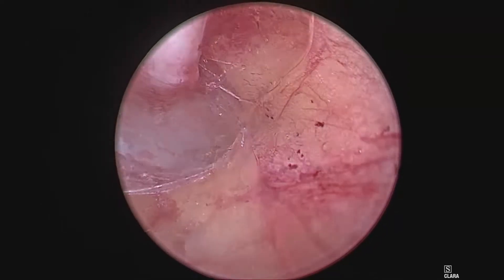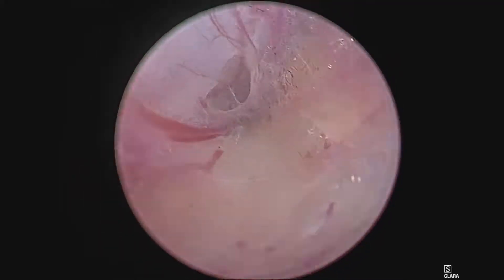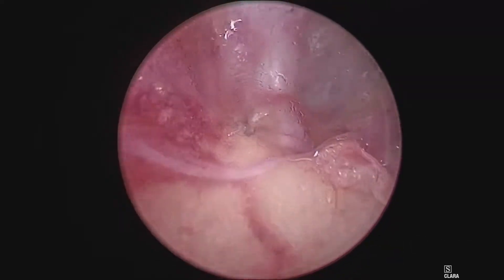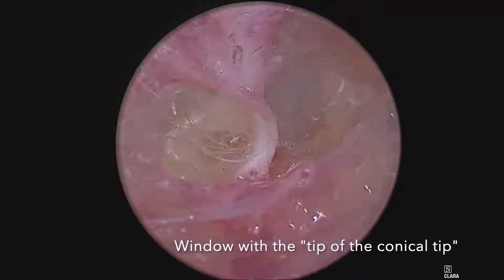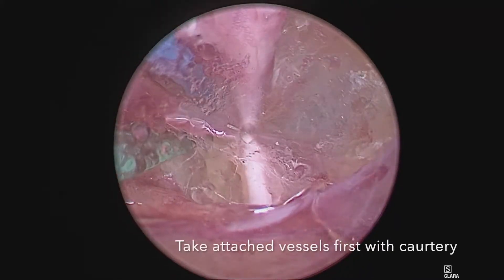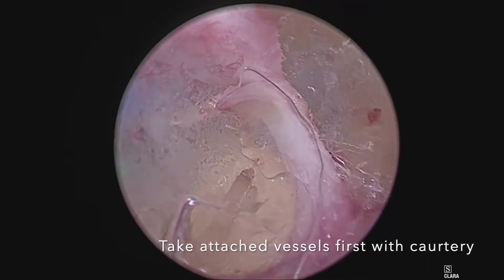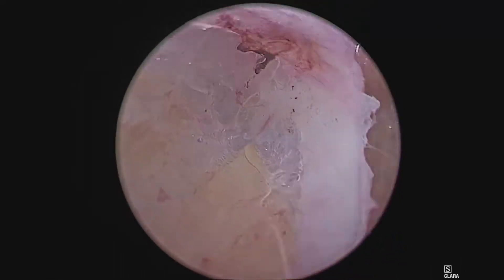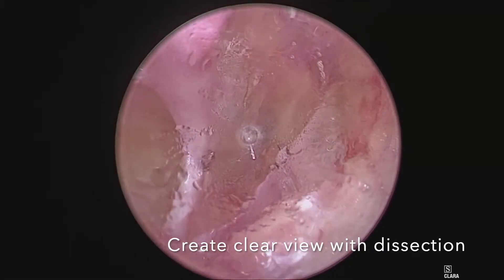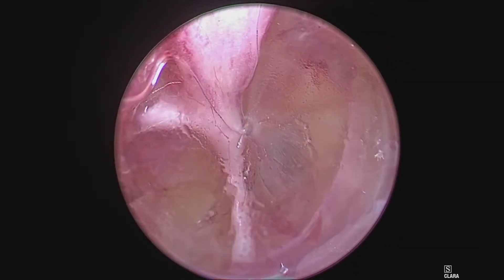Here I've identified a branch to the left, and I like to go past the branch on the vein with my dissection about 1 to 2 centimeters. Make a small window with just the tip of the conical tip. Here I have a crossing vessel that I cauterize and cut before taking the branch. I do this quite often and this helps reduce any bleeding that can occur with branch taking. My conical tip has moisture on it so I just do a little more dissection with the top and bottom of the cone — now I can see perfectly clearly.